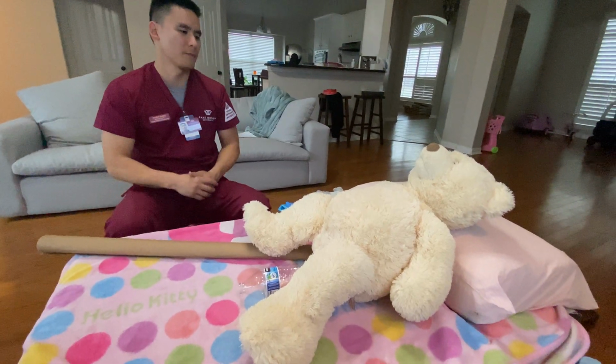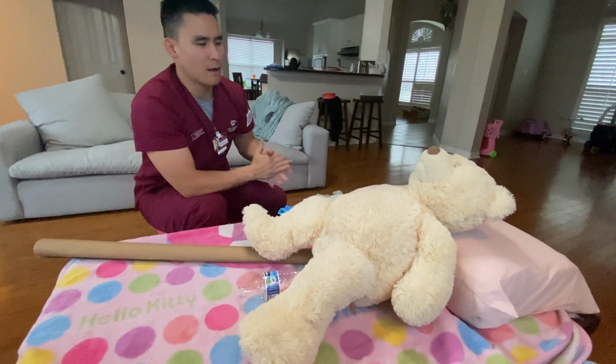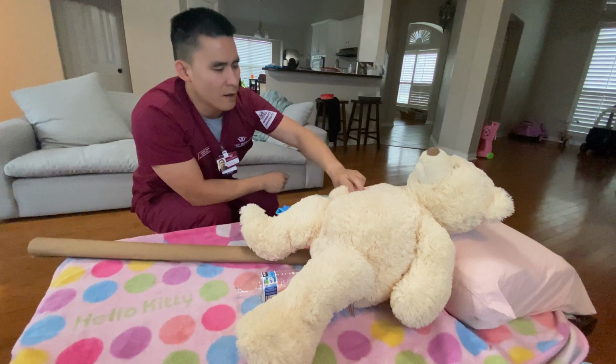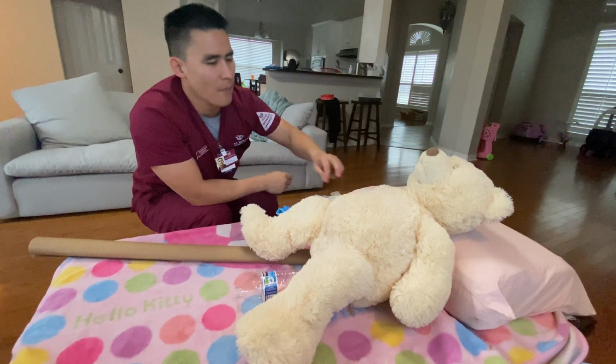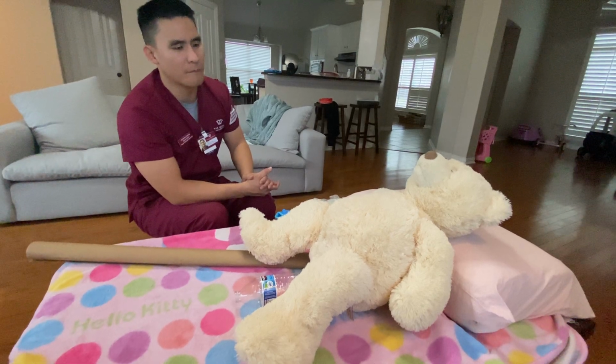Okay, excellent. So I'm going to go ahead and wash my hands here. And before we get started, can you tell me your name and date of birth? Okay, looks like it matches your ID band. And do you have any allergies to latex or iodine?